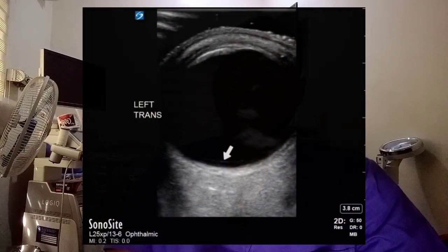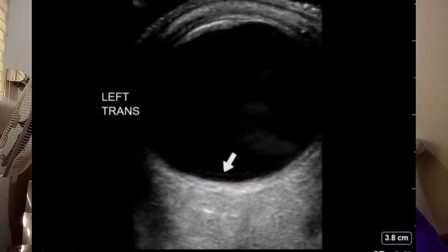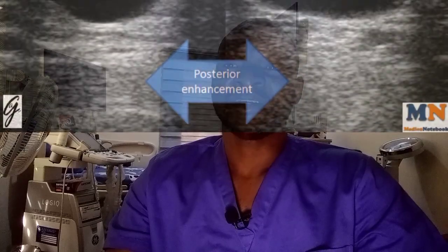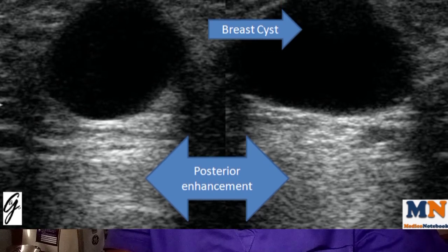The cystic fluid causes almost no attenuation of the sound. So adjacent to the cyst, the liver parenchyma, for example, does cause some attenuation, and this is compensated for by TGC, which makes the liver echoes uniform from the superficial to the deep aspect of the liver. The TGC overcompensates through the cyst, hence causing the deeper echoes to appear brighter.